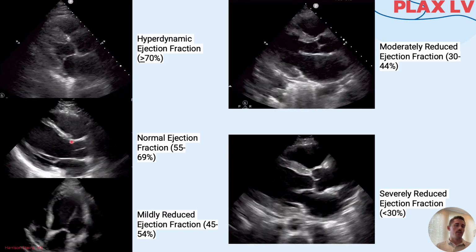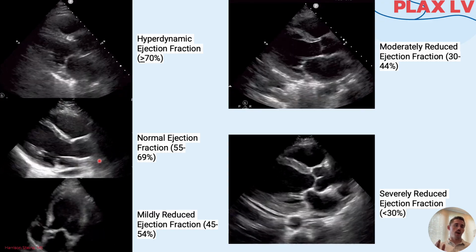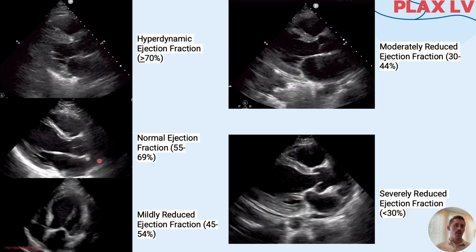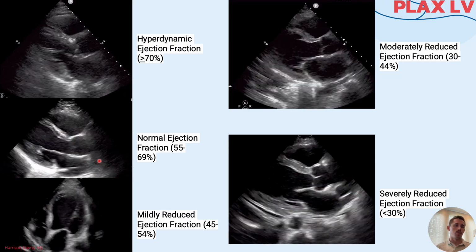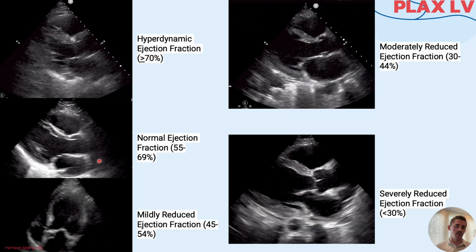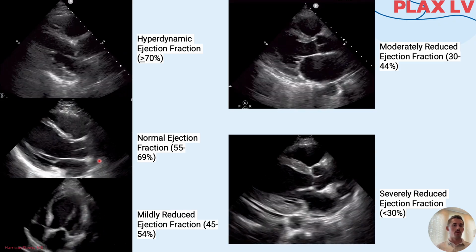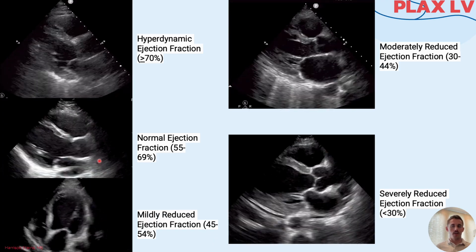We're looking at the ventricular wall motion. So at the interventricular septum and the ventricular wall, they're coming together well in systole and pushing out well in diastole. Same thing with the bit of the right ventricle that we can see there. We're also looking to see that there is no stasis of one part of the wall. The walls are moving symmetrically and all together.